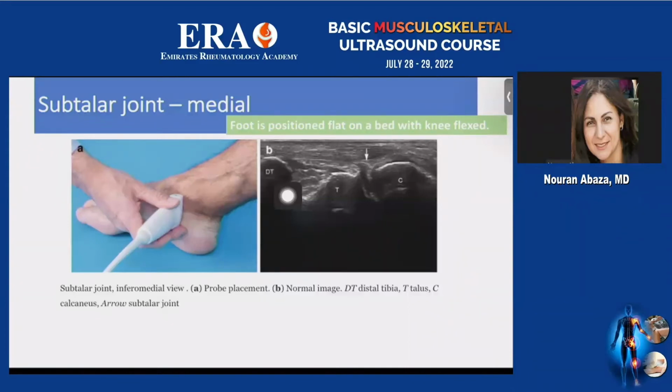And you will be perpendicular to the sole or perpendicular to the examination table. You will also visualize the talus and then the calcaneus. Those are your bony landmarks. So here in this view, you are visualizing the subtalar joint from the medial aspect. And always the patient position is supine, on his back, with the knee flexed and the foot positioned flat on the bed.